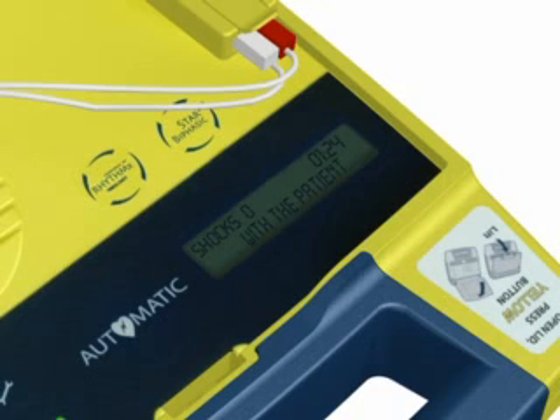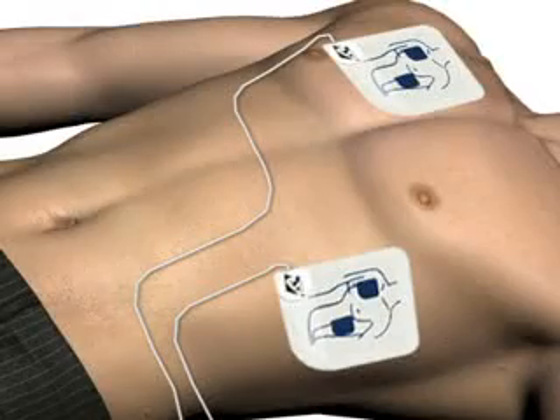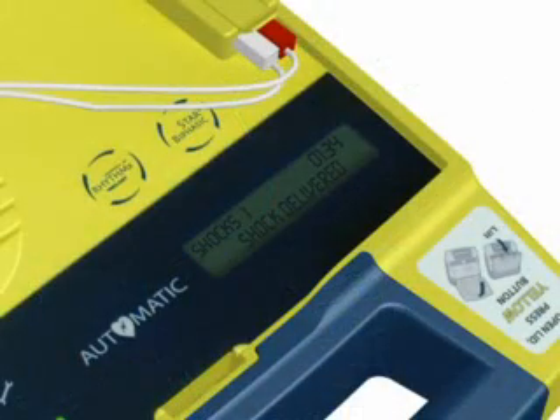Preparing shock. Move away from the patient. Shock will be delivered in three, two, one. Shock delivered. It is now safe to touch the patient.